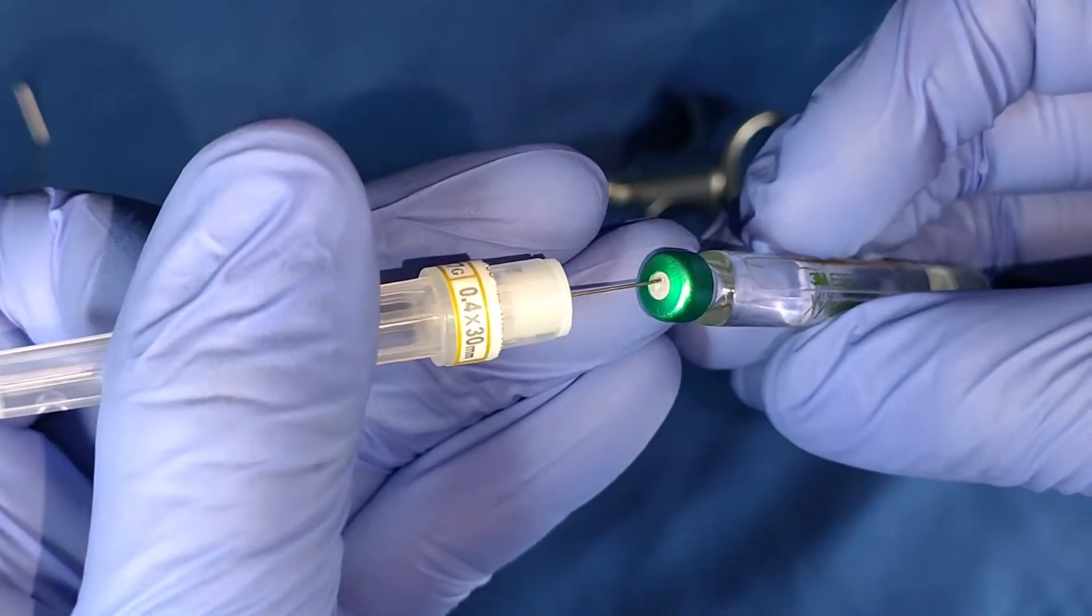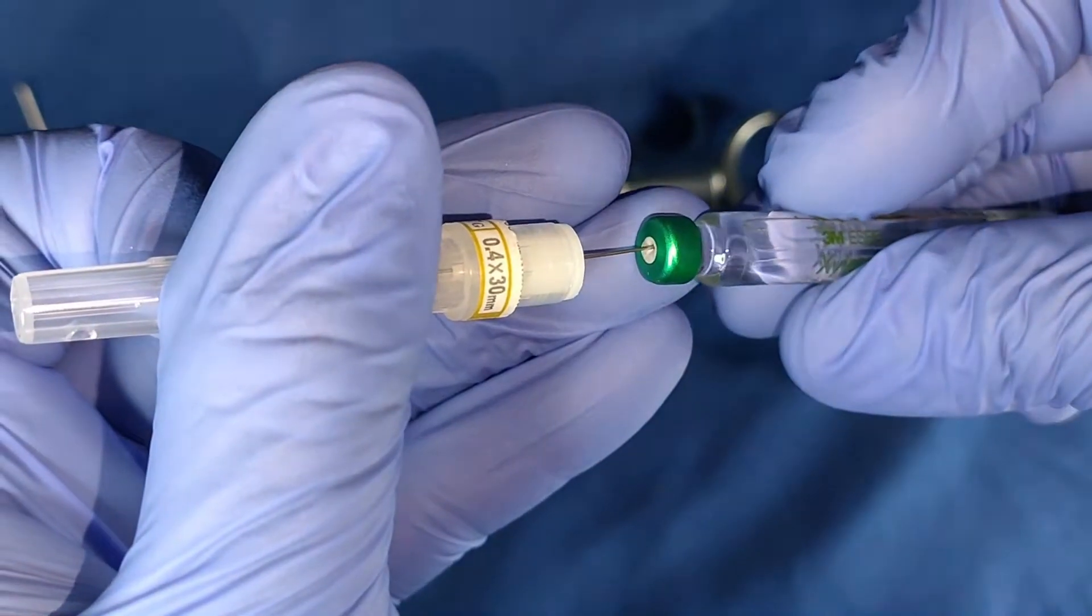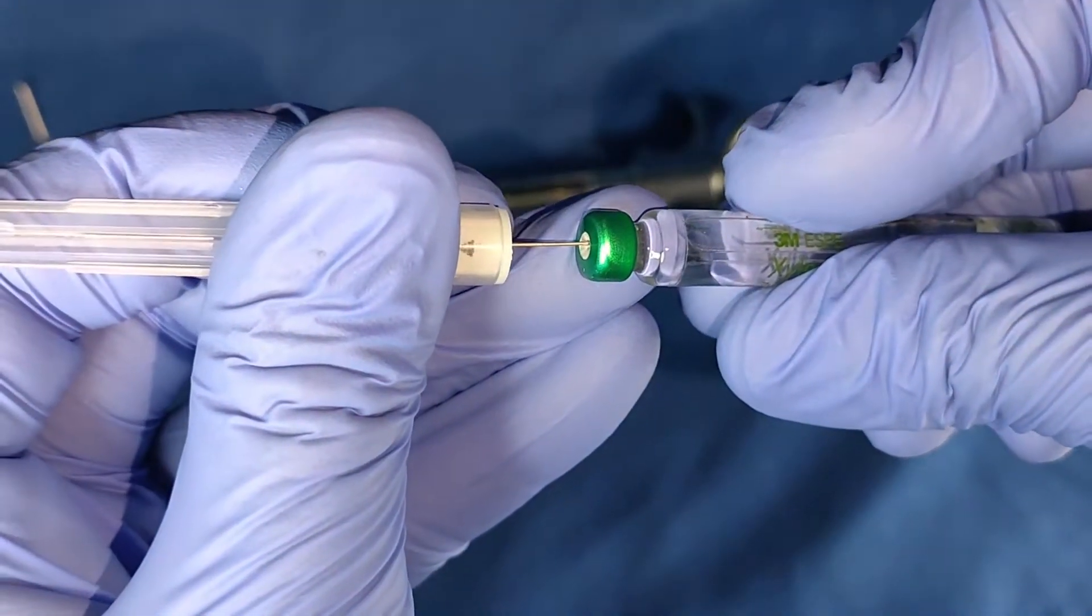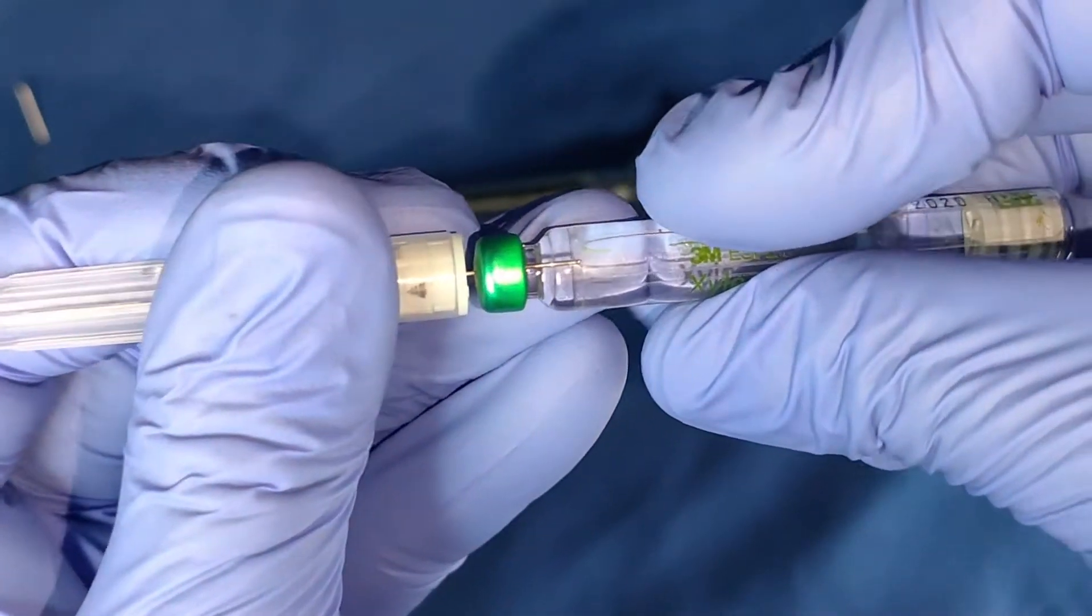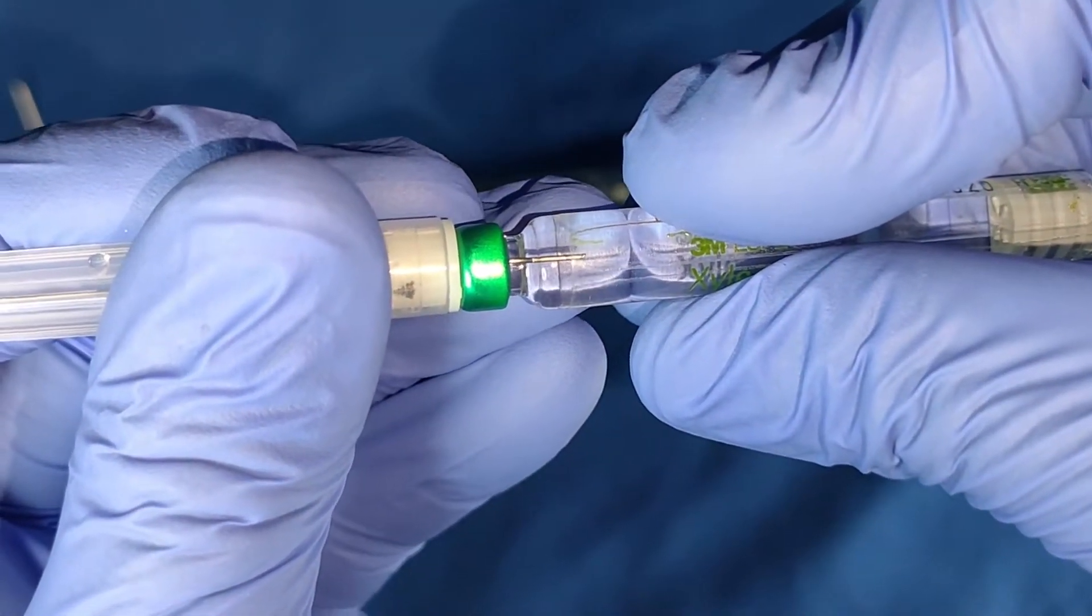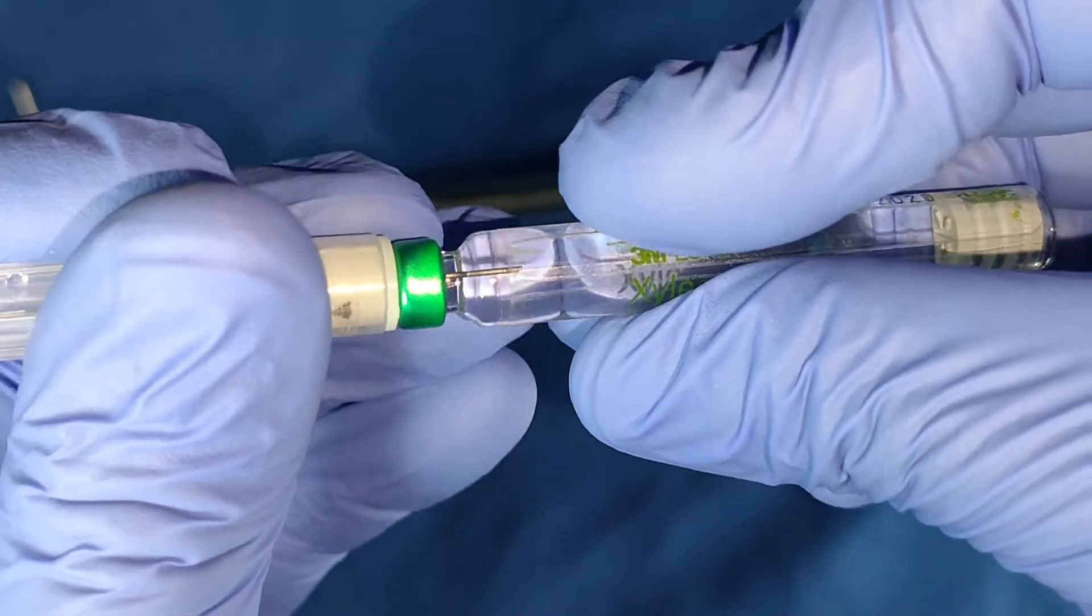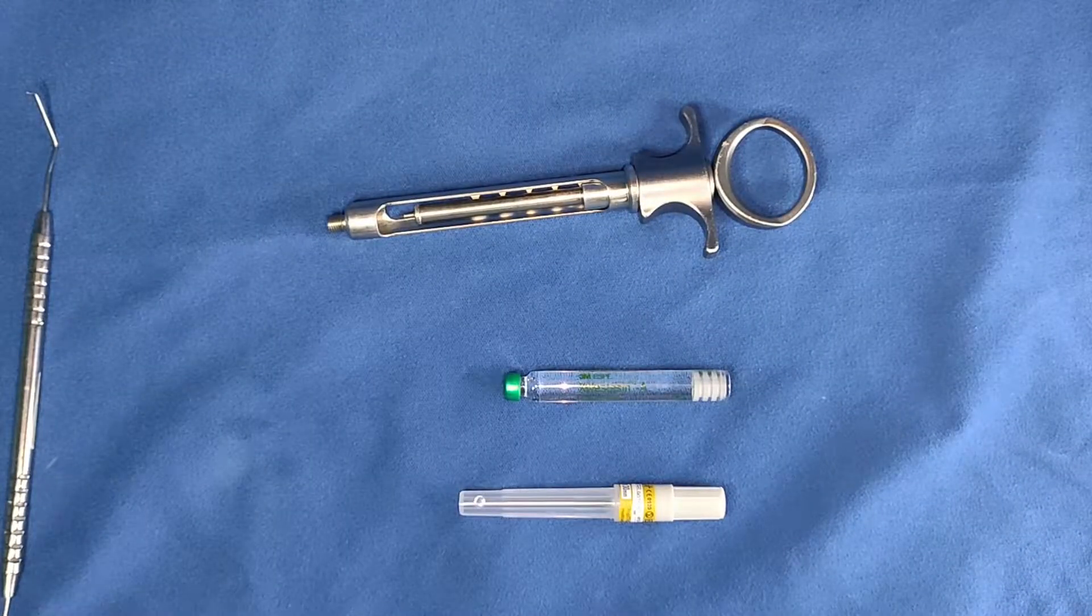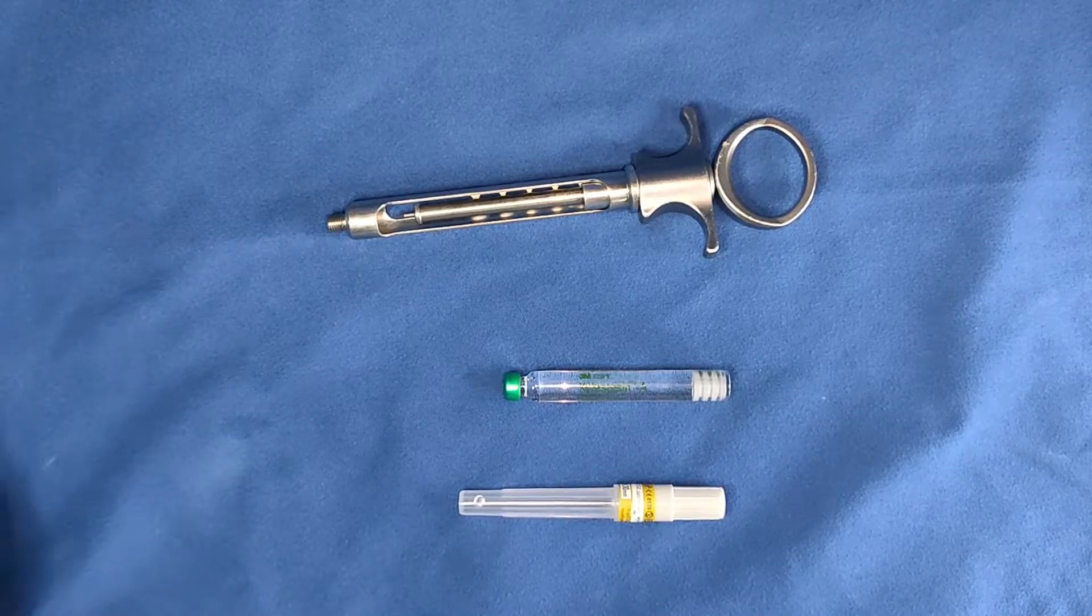This is the cartridge penetrating end of the needle. It will make contact with the rubber diaphragm later. I'll just show you what happens. Here we have the cartridge penetrating end inside the carpule. Now I'll show you how to assemble it properly.